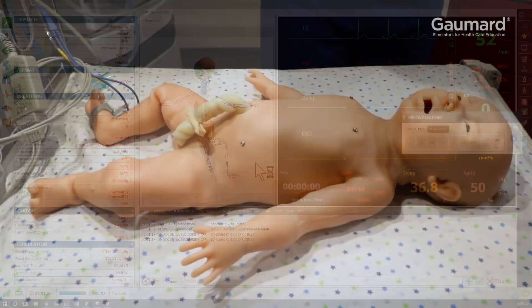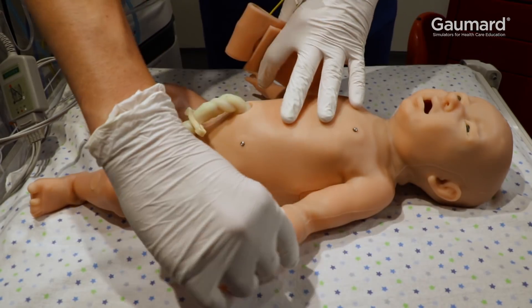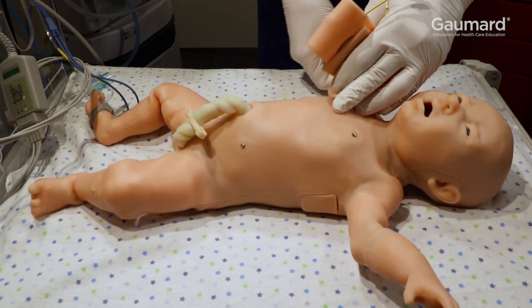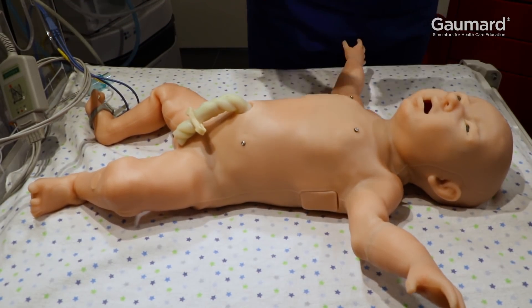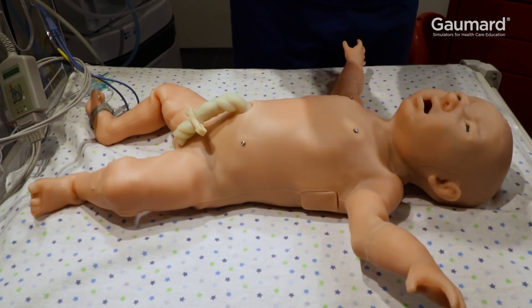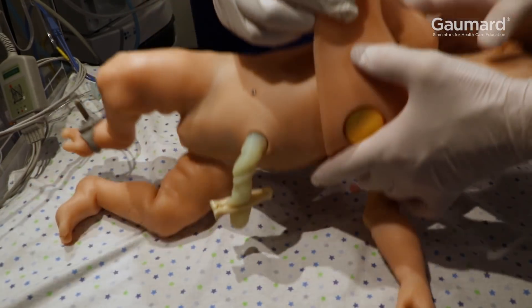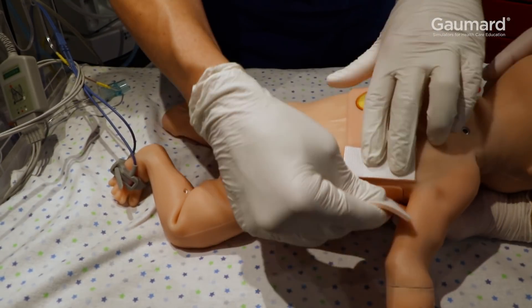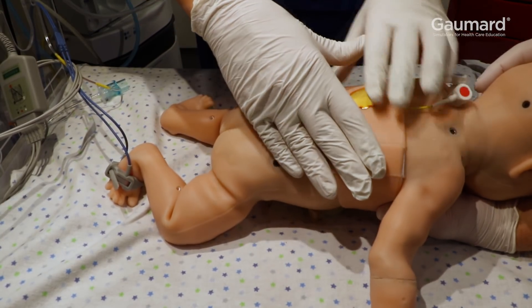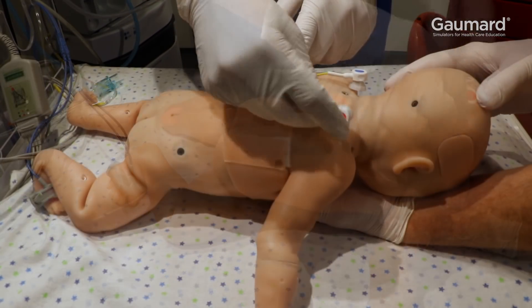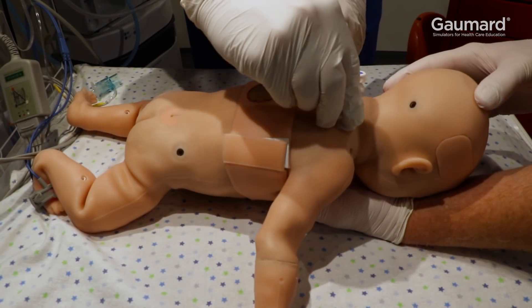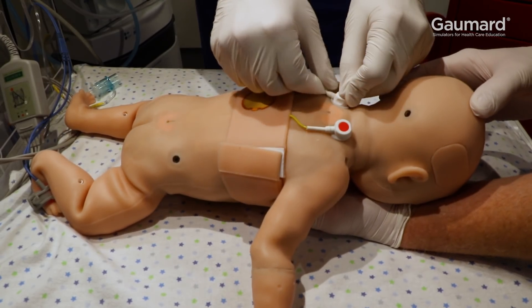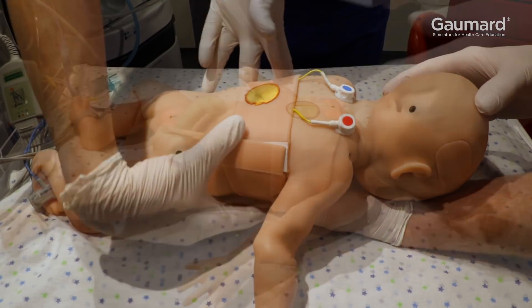To set up for defibrillation with live energy, attach the anterior-posterior defibrillation pad adapter. Lift SuperTori's arms and place the adapter around the torso. Secure the adapter with the Velcro strip under the right arm. Plug the red defibrillation cable into the port behind the right shoulder and the blue cable into the left.